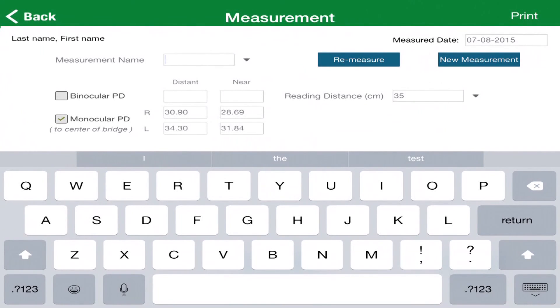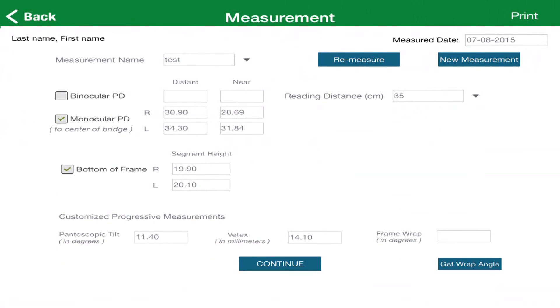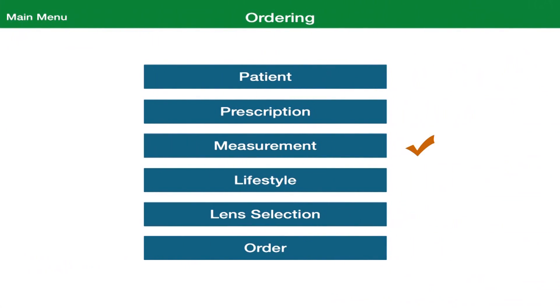Be sure you enter a name for the measurement in the Measurement Name area. When you are done, touch the Continue box on the bottom of the screen to have your data saved. You will be taken to the next screen, and from there you can select another option to continue the ordering process.